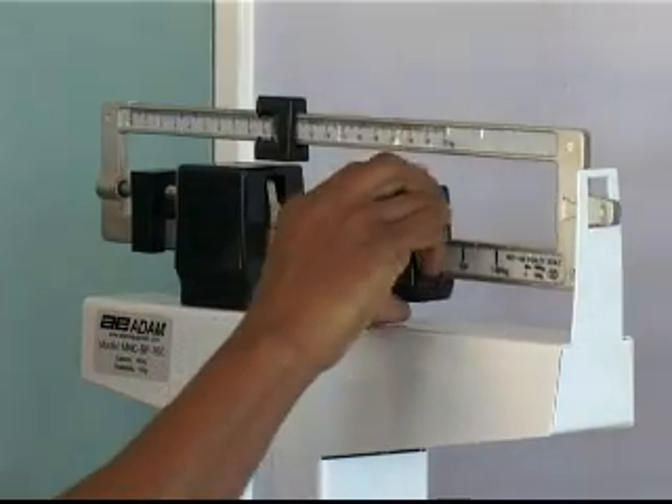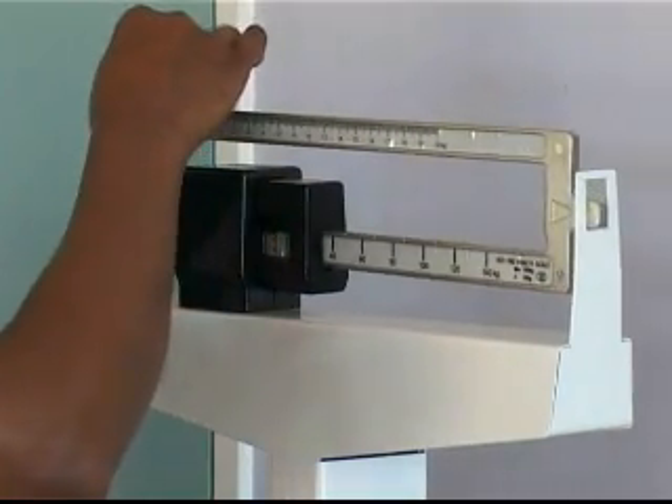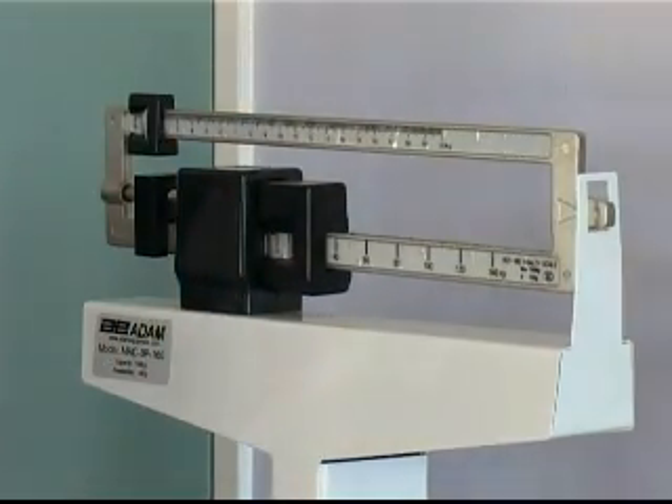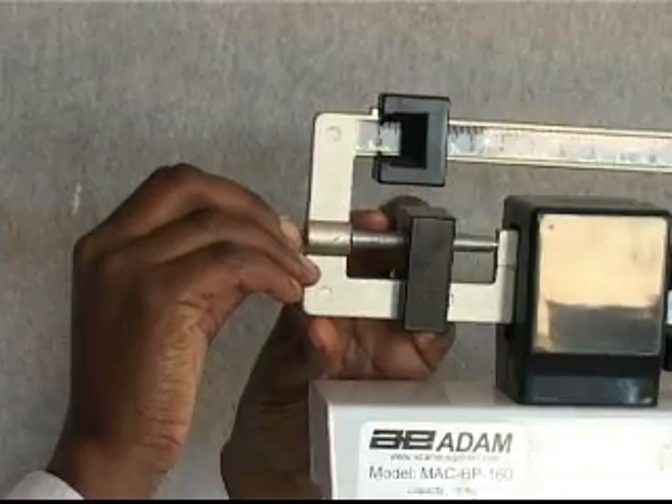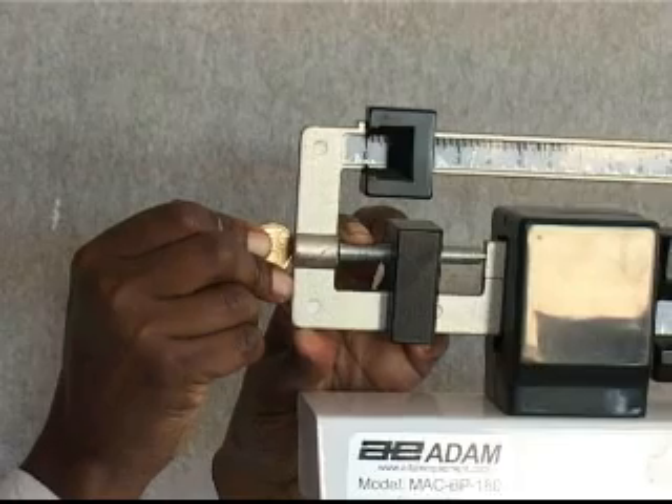First, move the poises to the zero position. If the arm is not balanced, then calibration is needed. Beam type scales can be zeroed by turning the adjustment screw with a screwdriver or a coin.